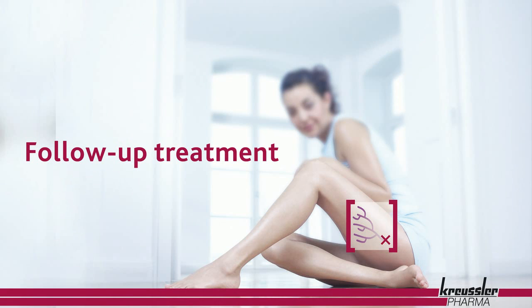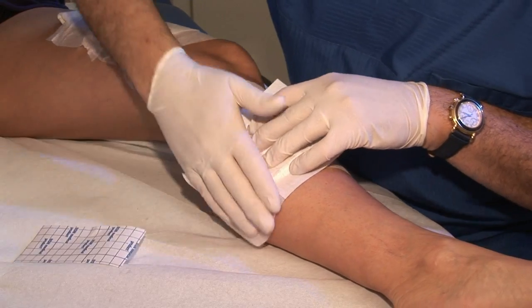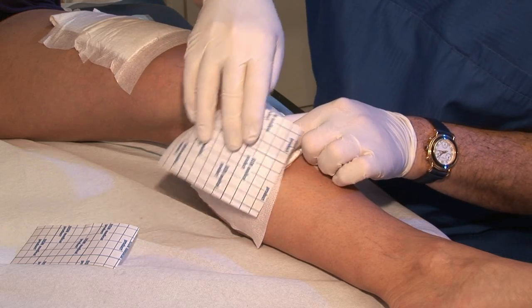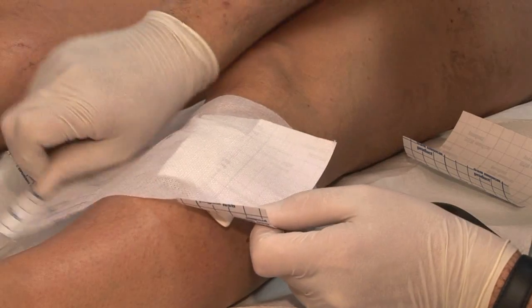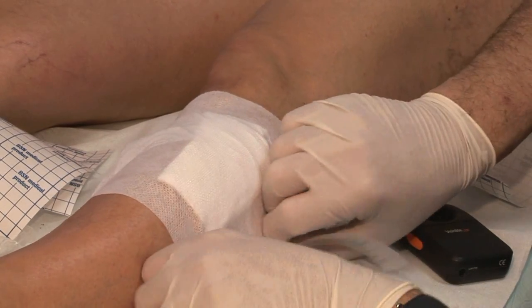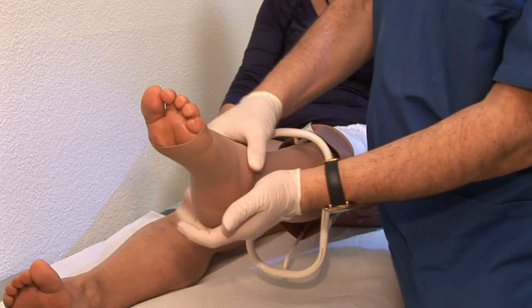Follow-up treatment. The injection is followed directly by local compression, which can be greatly increased by eccentric compression using pressure pads in the treated area. Compression pads can include a rolled-up ball of cotton wool or a compress, fixed over the treated veins with adhesive film or tape. Subsequently, a compression bandage or a compression stocking is applied.